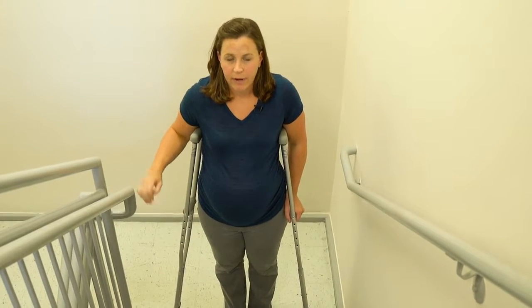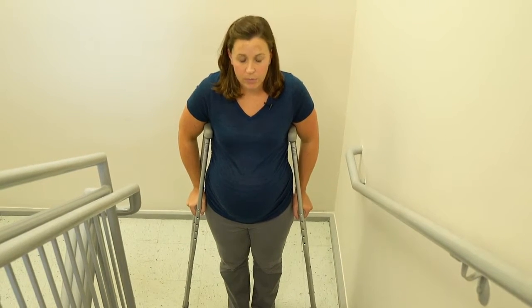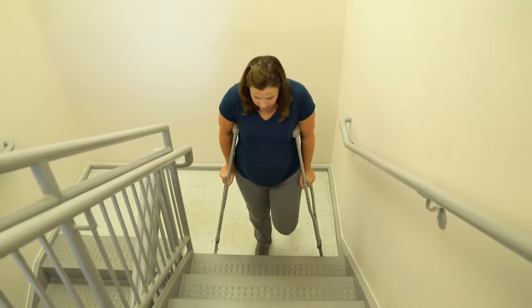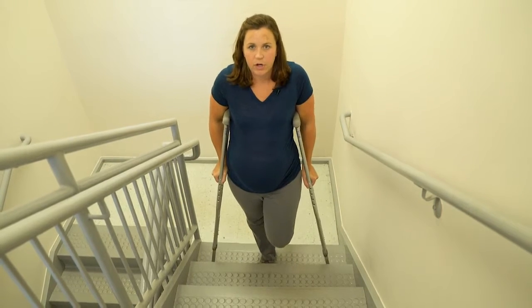If you can't put any weight through your leg and you don't have a railing, you're going to still use the crutches on both sides. Put the leg behind you. You're going to push through your arms, hop up, and then bring the crutches up with you.